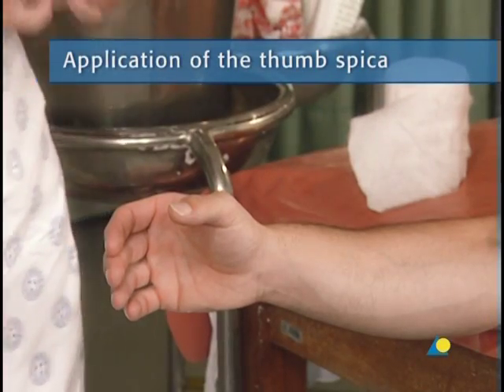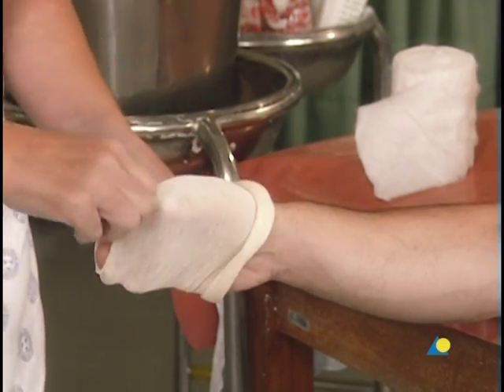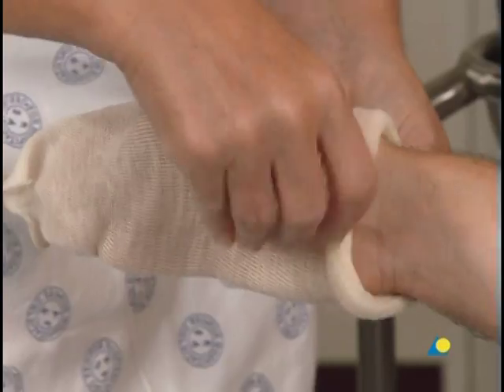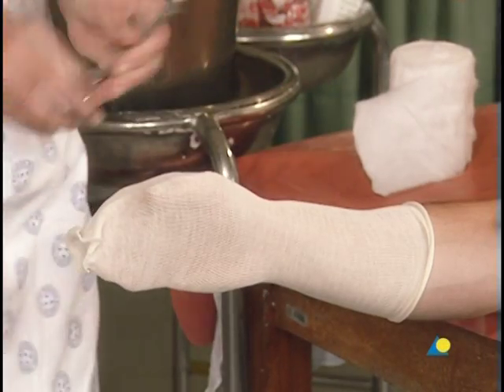To begin, a stockinette is applied and cut slightly longer than the final cast will be. A small opening is then cut for the thumb.